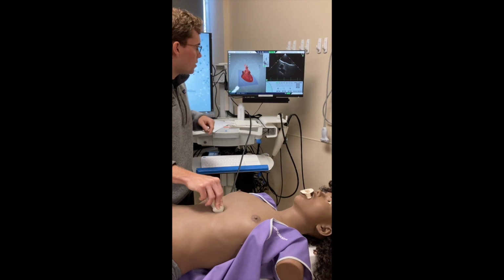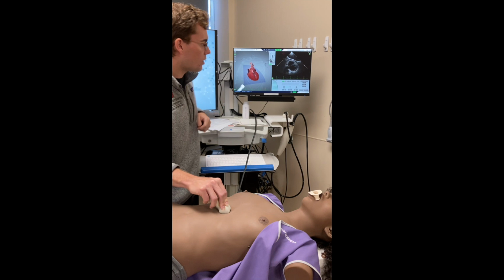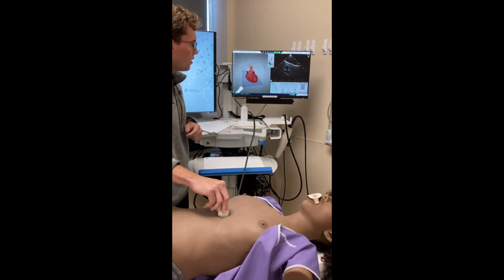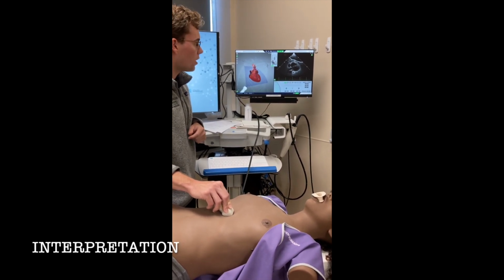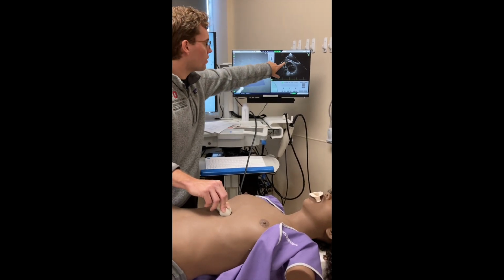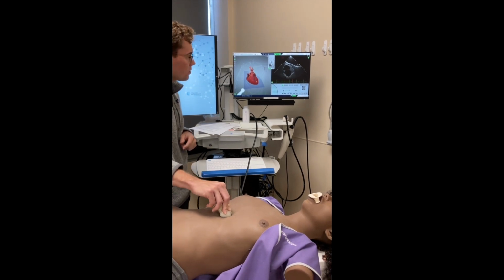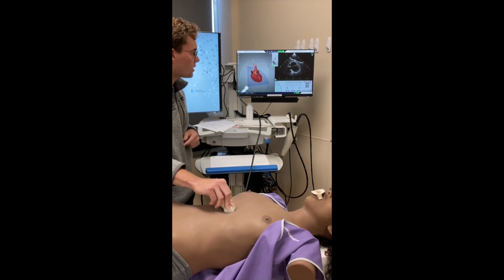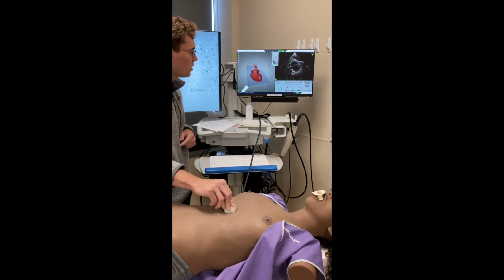Other things you can sometimes see are your aorta, and the descending thoracic aorta is always going to be posterior to your left atrium. So when you're scanning, for your interpretation, look for cardiac contractility, just kind of a global picture, and any effusions that you can see around the heart. Here this is your normal physiology, so you're not going to see any of that. When you're sweeping through, sweep through the entire heart, because effusions can hide anywhere. It's not always going to be obvious.